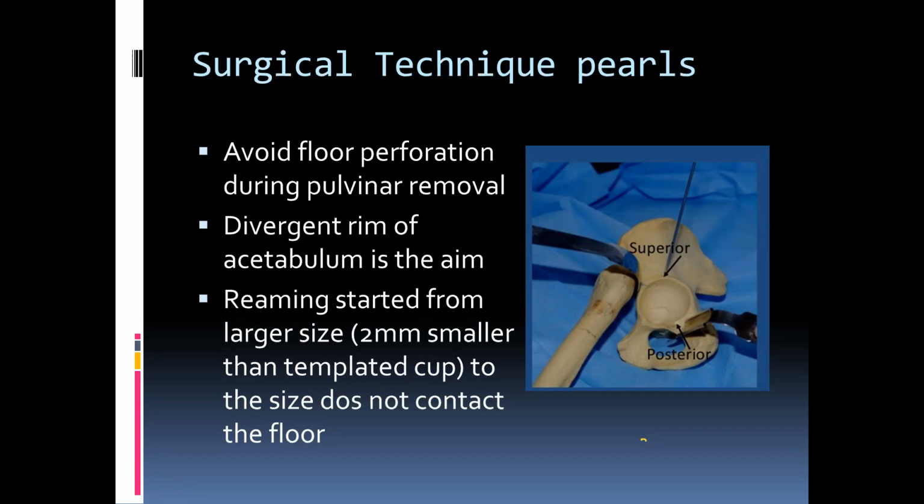For example, if you choose 46 and you put it inside and you see that it will ream the medial wall, you have to stop right away.